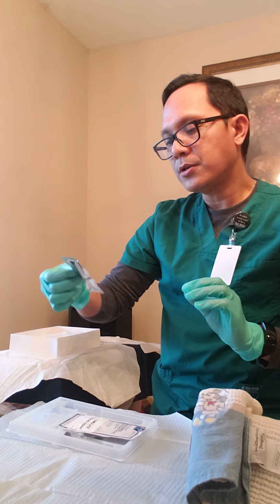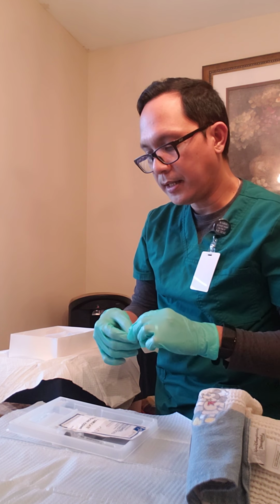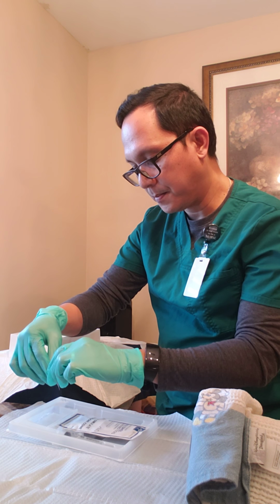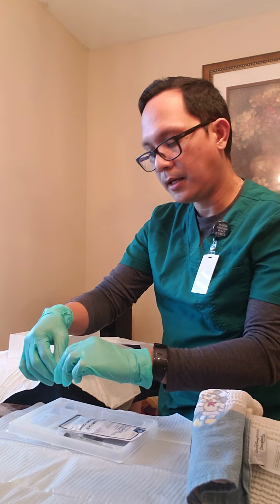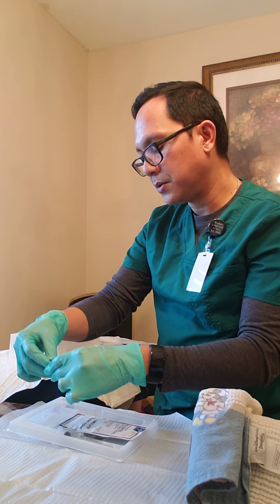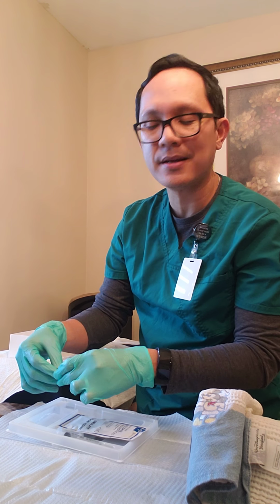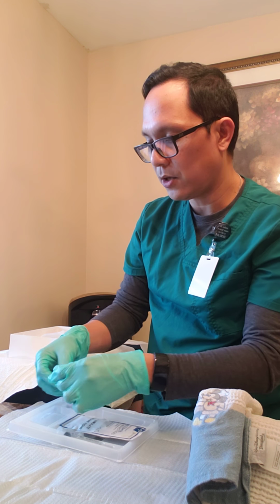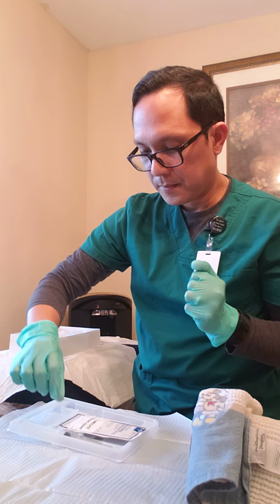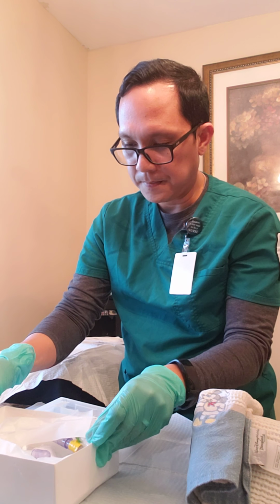And then I also have here the lubricating jelly. I'm going to open it and put it in my canister in here, and we are going to be using this one to lubricate the tip of the Foley so it's easier for insertion. Okay, pretending I opened it already. And I'm going to bring also the Foley kit.